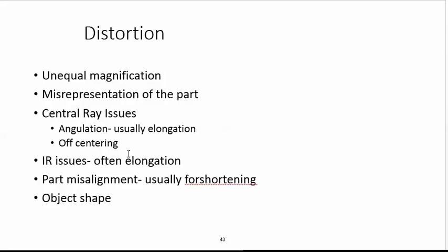So if you have your flashlight, what you can do is you can tilt an object in the light field and see what happens to the appearance of the object. What you'll get is, as something tilts up, like on my desk right now is a pair of scissors. If I tilt the pair of scissors up to where the sharp end is closest to my desk and the handle elevates, then what I'm going to get is a distorted view of my handle, and really the scissors all the way across the board, but I'm going to have magnification of the handle where I'm not going to have magnification of the point of my scissors.